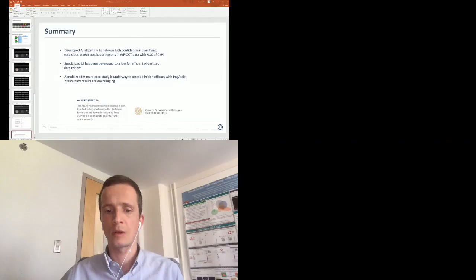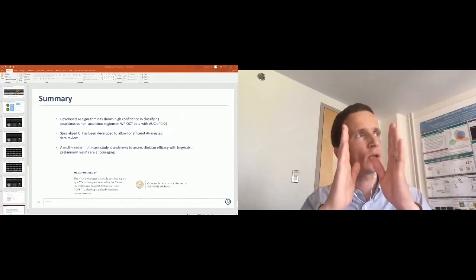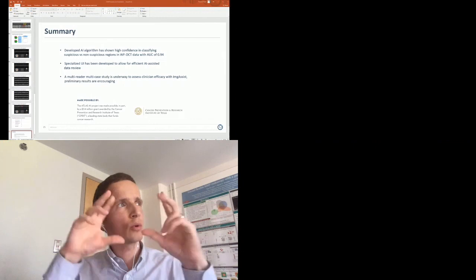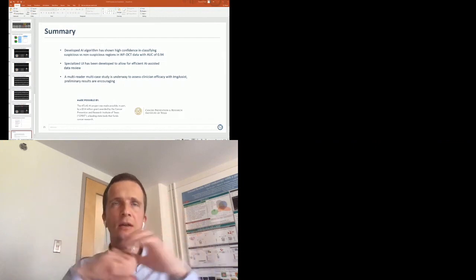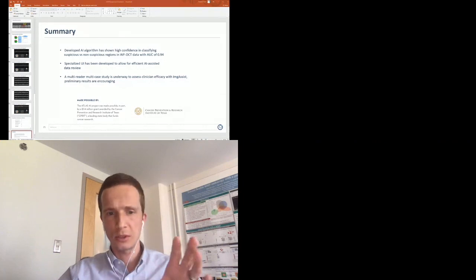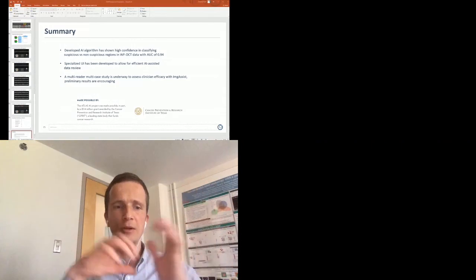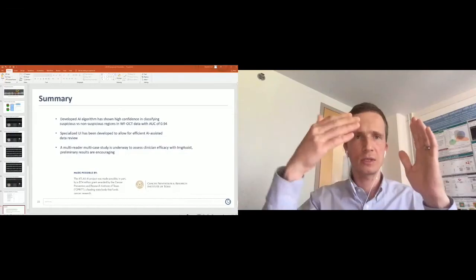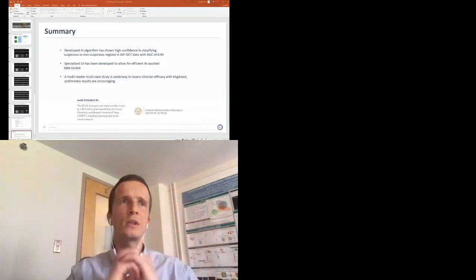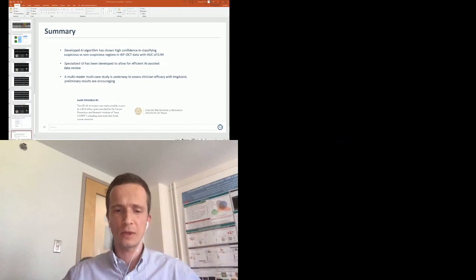Related to that, you just have a label in the lateral direction. It's a certain area of the scan. But your patches seemed also to translate in depth. So I was wondering, since you at least alluded that this is also a convolutional architecture, isn't there a fundamental issue with OCT images, at least in cross-section, not being that invariant, because the images obviously look very different deeper inside the tissue, and at one point fade out? Can you comment on that?